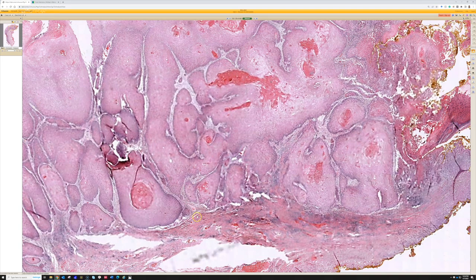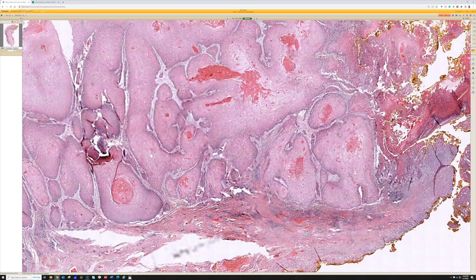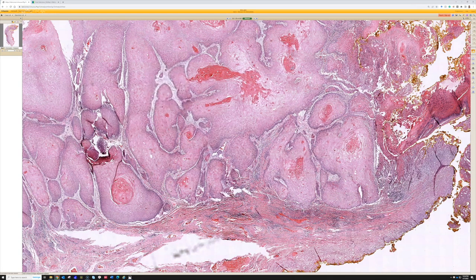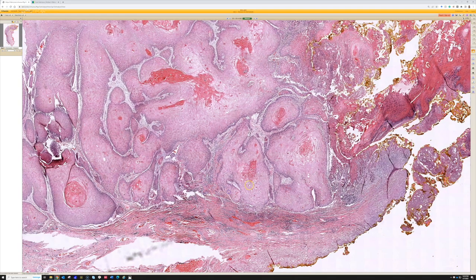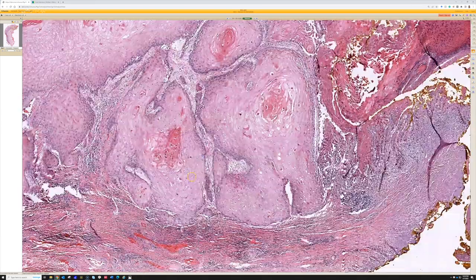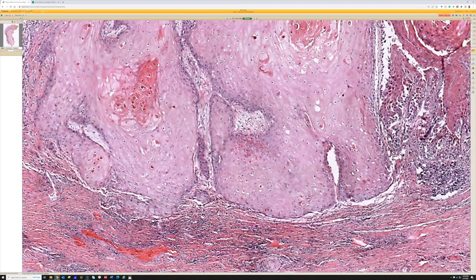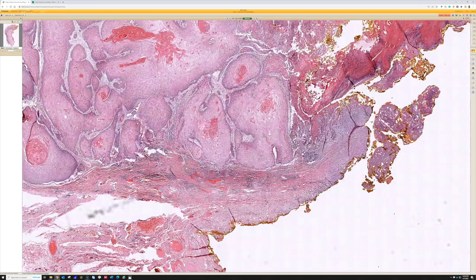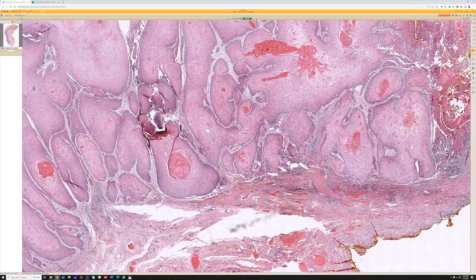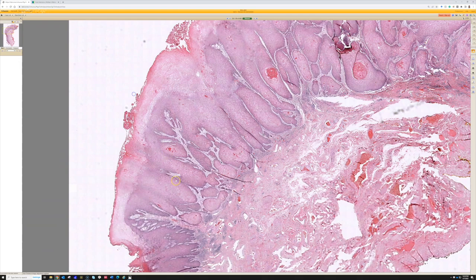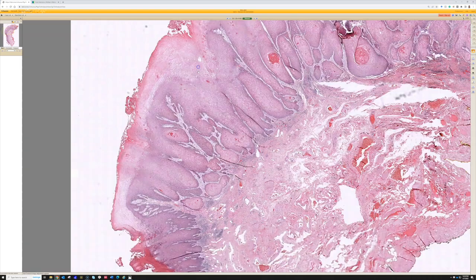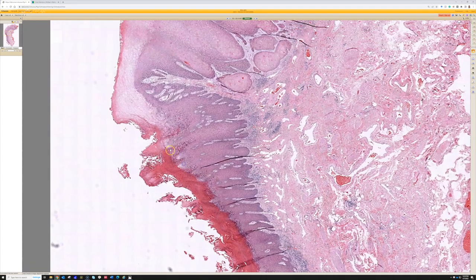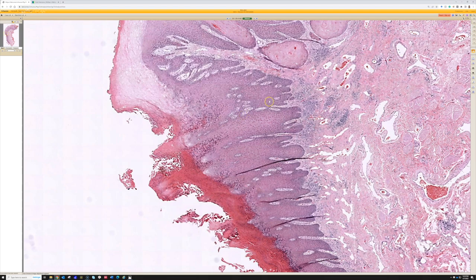Hyalos is the Greek word for glass, and in pathology 'hyalinized' means homogenous smudgy pink. The keratinocyte nuclei are actually quite small and bland — not much nuclear atypia — just abundant glassy cytoplasm and these broad big rete ridges becoming bulbous and expanded, pushing deeply into the dermis. On the surface there's some degree of verrucous architectural change, and you can see a little bit of a warty look. So this is verrucous carcinoma.